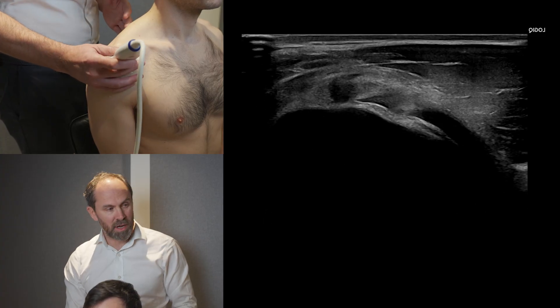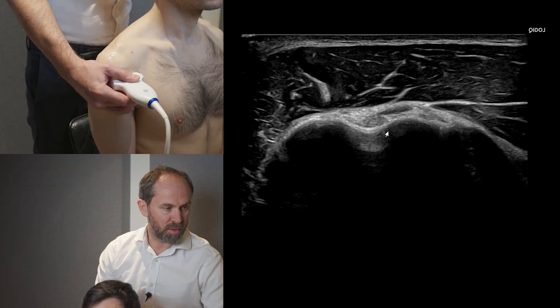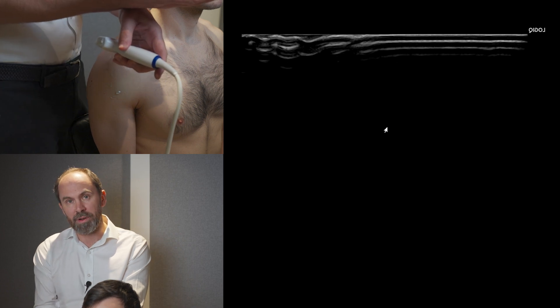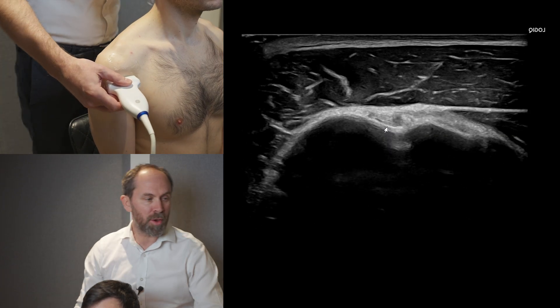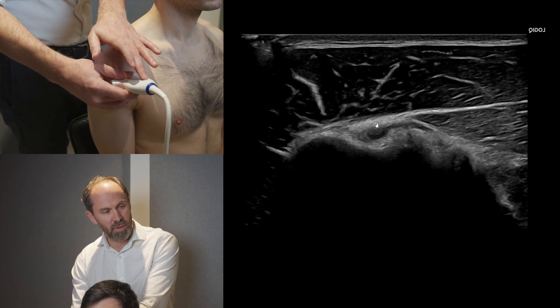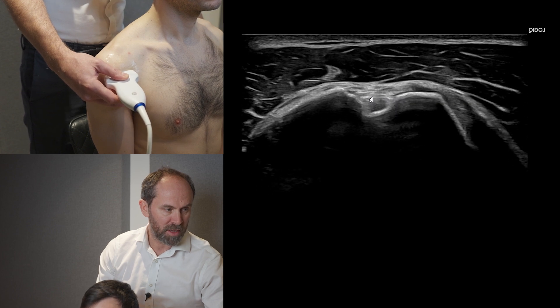Don't start up high — you need to start a little bit further down the arm and just locate the humerus. This is the humerus here; we can see the bicipital groove. If you haven't found it, check the patient is in a neutral position, because many patients will go into medial rotation and it will hide medially under the coracoid. Also, make sure the bone is bright by tilting the probe — the wire should point slightly downward. Remember: if the bone is bright, the soft tissue is right.